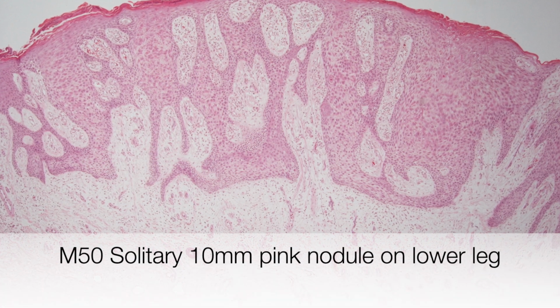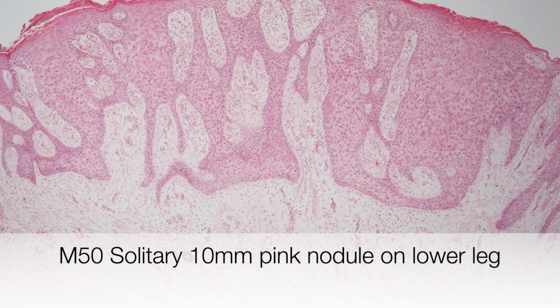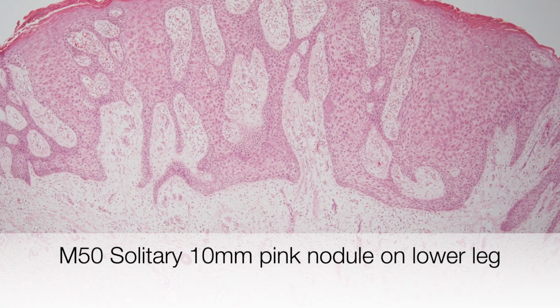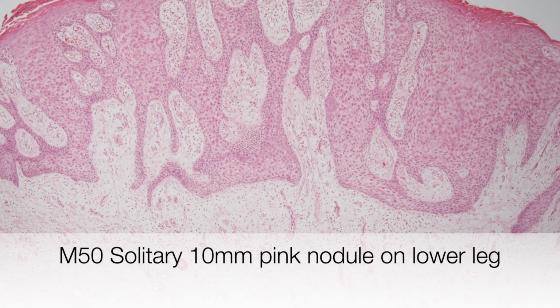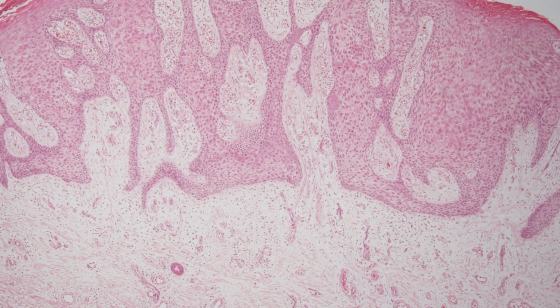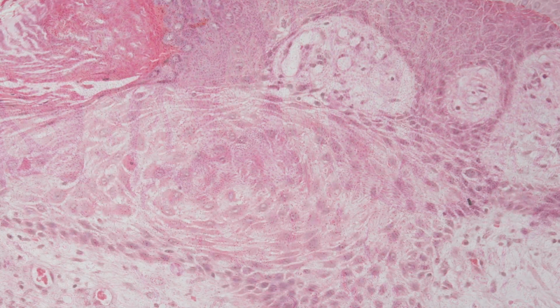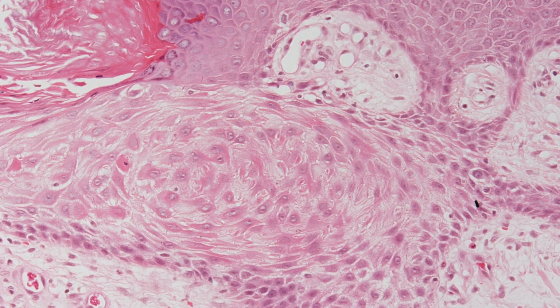The first case is a male of 50 with a solitary 10mm pink nodule on the lower leg. What is it? Here is a higher power view.